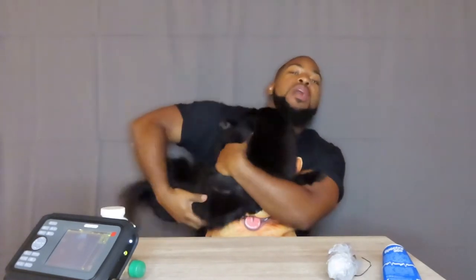So I was able to see her pups on an ultrasound machine at about 34 days, 35 days, because she's larger. I also have another Pomeranian that's a lot smaller, and it didn't show up right away.